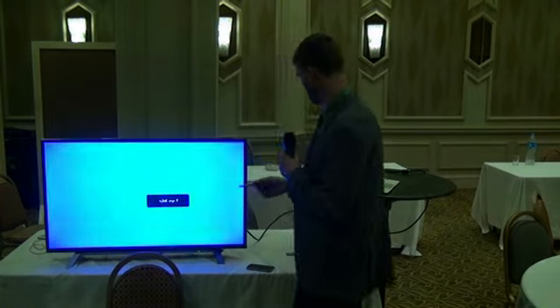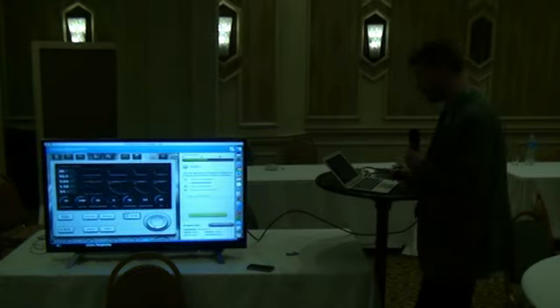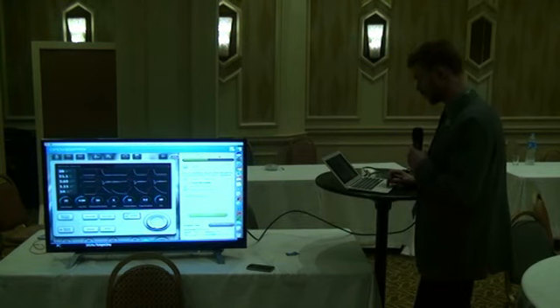And that, I think that's my screensaver. Okay, so let's do that. So we're going to increase the oxygen to 100%. Yeah.